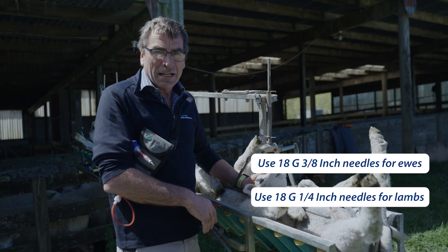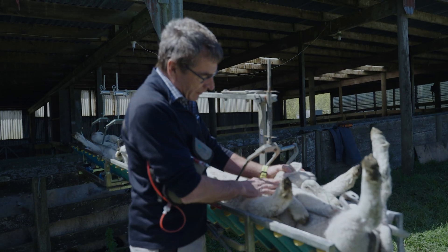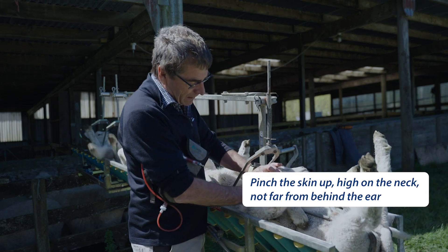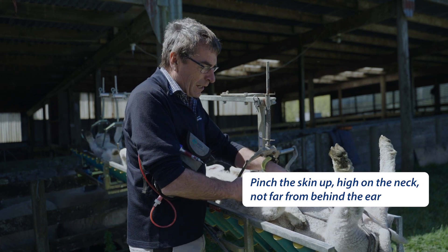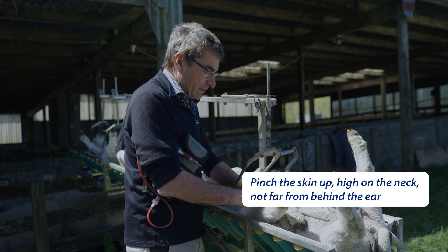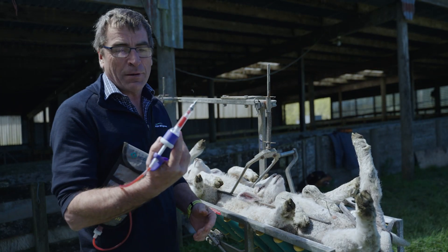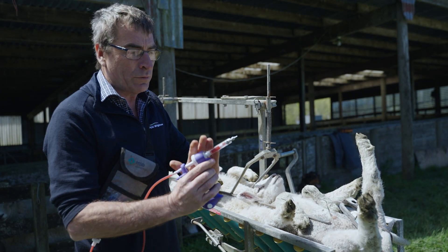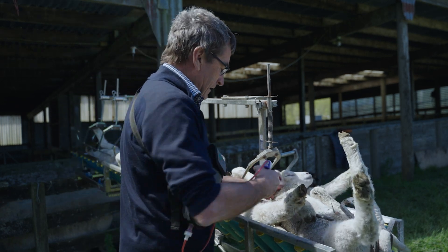When vaccinating lambs, the site that we inject them is very important. I'm going to go high in the neck, not far behind the ear, and I'm going to pinch the skin up. We don't want to be going anywhere near the brisket, because we're more likely to get lesions. So it's important that you get good access to the lamb's head so you can vaccinate it. I've got my gun set at two mils, with a sharp 18 gauge, quarter inch needle. I'm going to vaccinate these lambs.